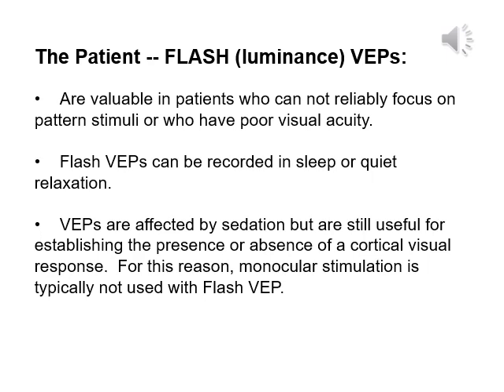The VEP waveform, however, is affected by deep sedation, but it's still useful for establishing whether a cortical visual response is present or absent. So the most useful thing for a VEP is to establish cortical function. And so for this reason, we don't often do monocular stimulation with the flash VEP.